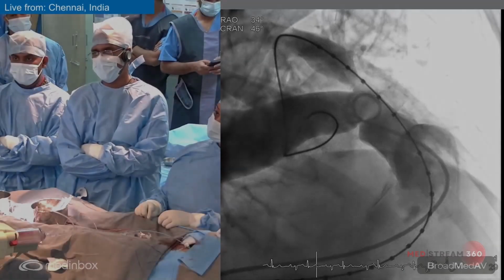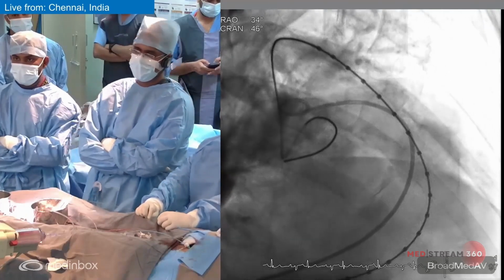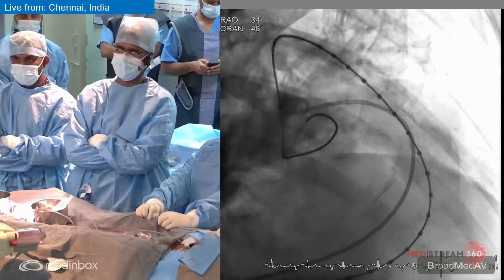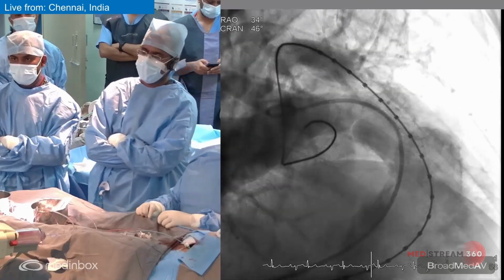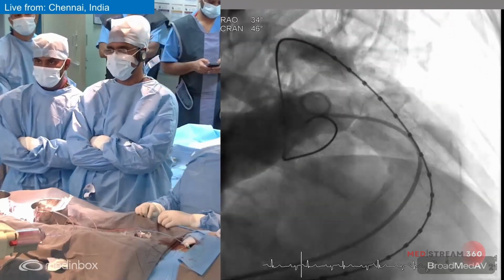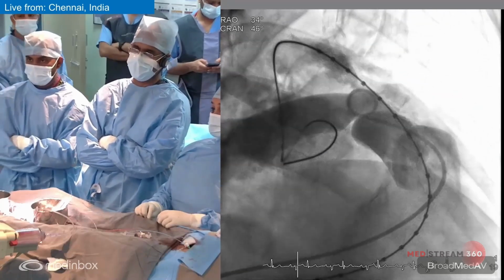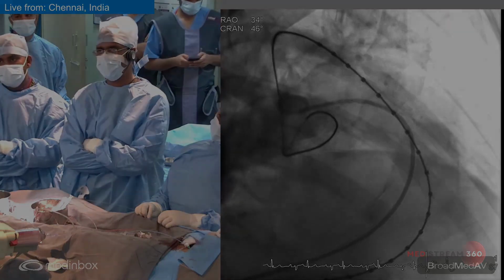We can appreciate that the right ventricular outflow tract is sort of pyramidal. There are calcifications in the region of the VSD patch. There is also calcification in the region of the proximal right ventricular outflow tract, which was originally reconstructed with a polytetrafluoroethylene membrane or Gore-Tex membrane. The RVOT is pyramidal. The distal RVOT or the distal pulmonary trunk seems narrow. The right pulmonary artery is quite roomy. The left pulmonary artery is severely narrowed.